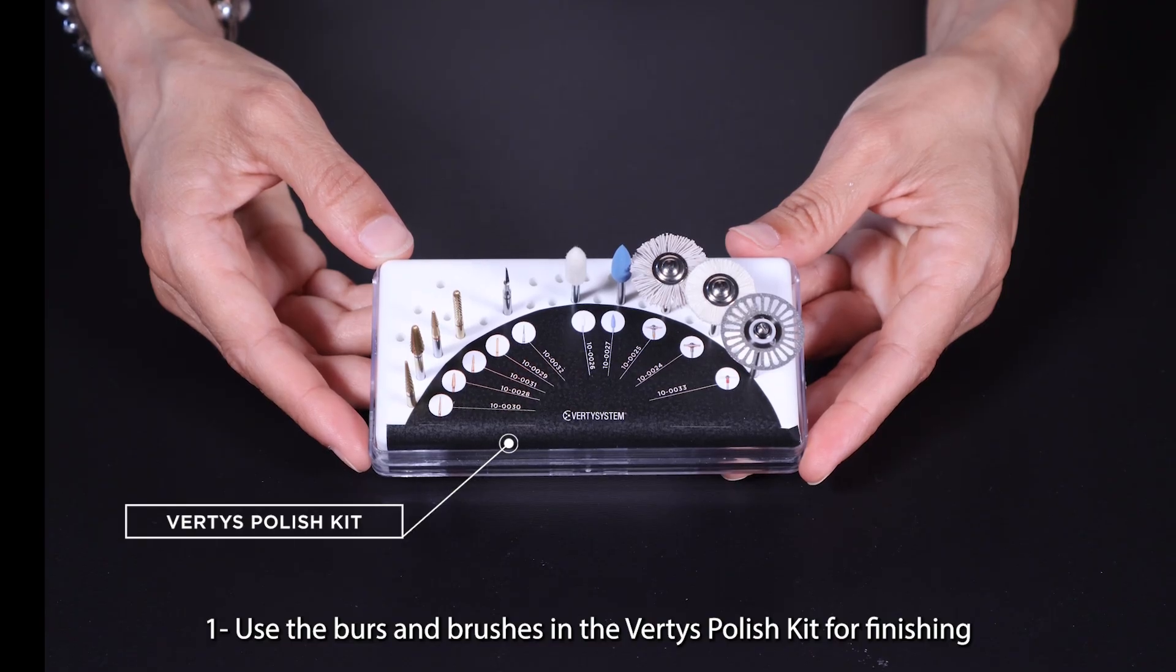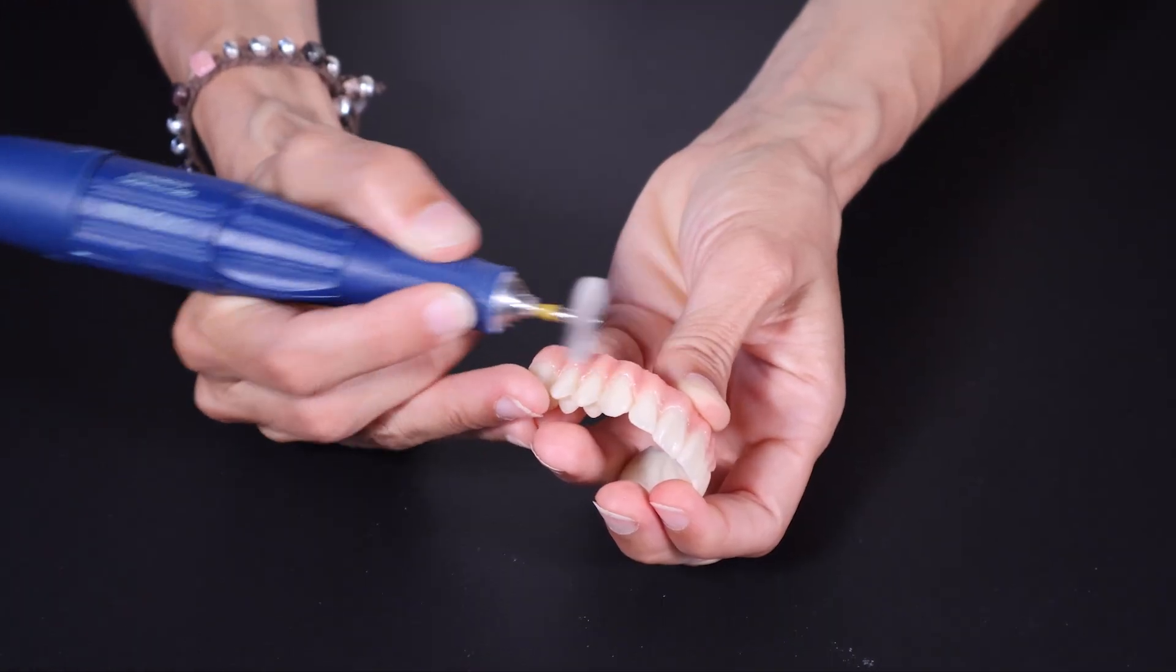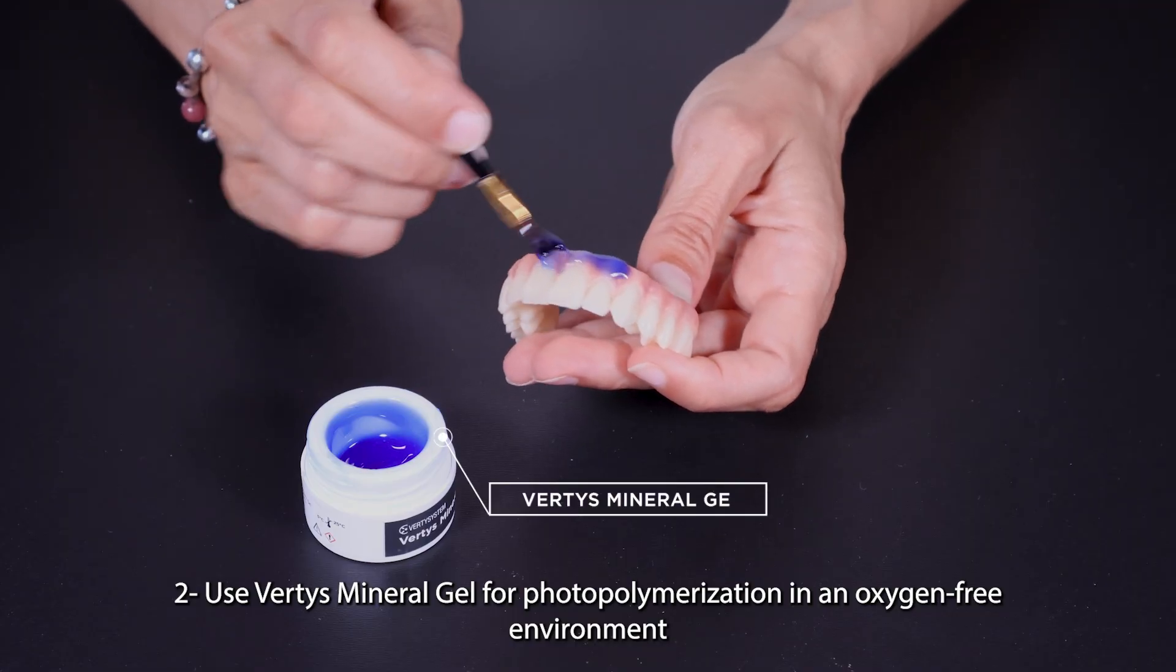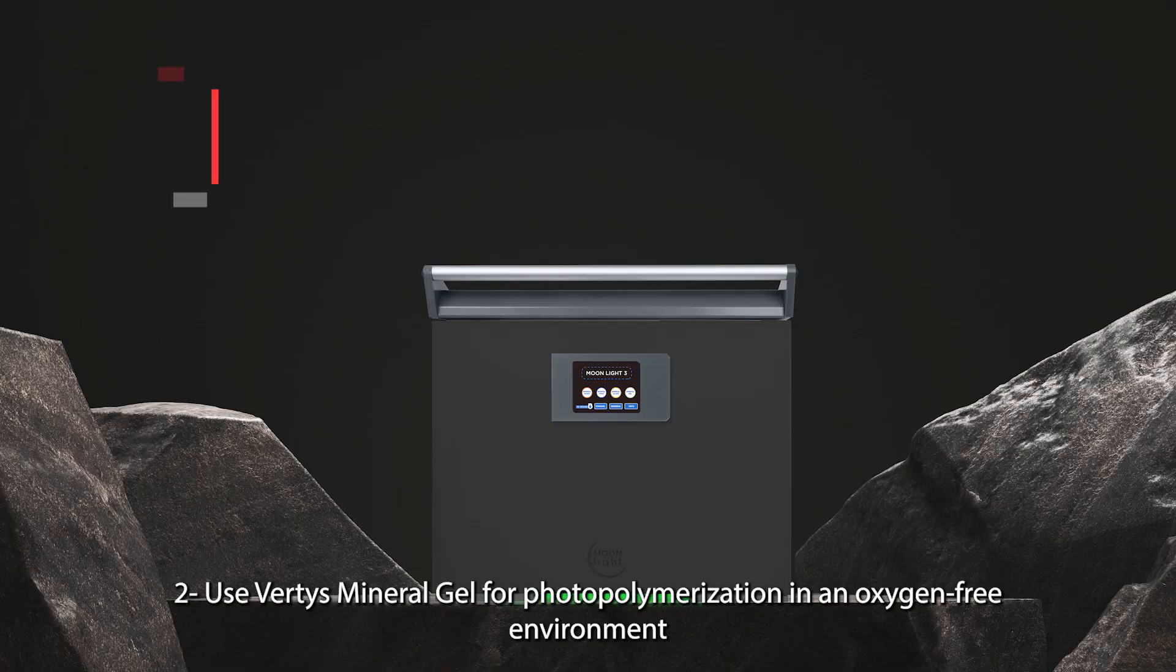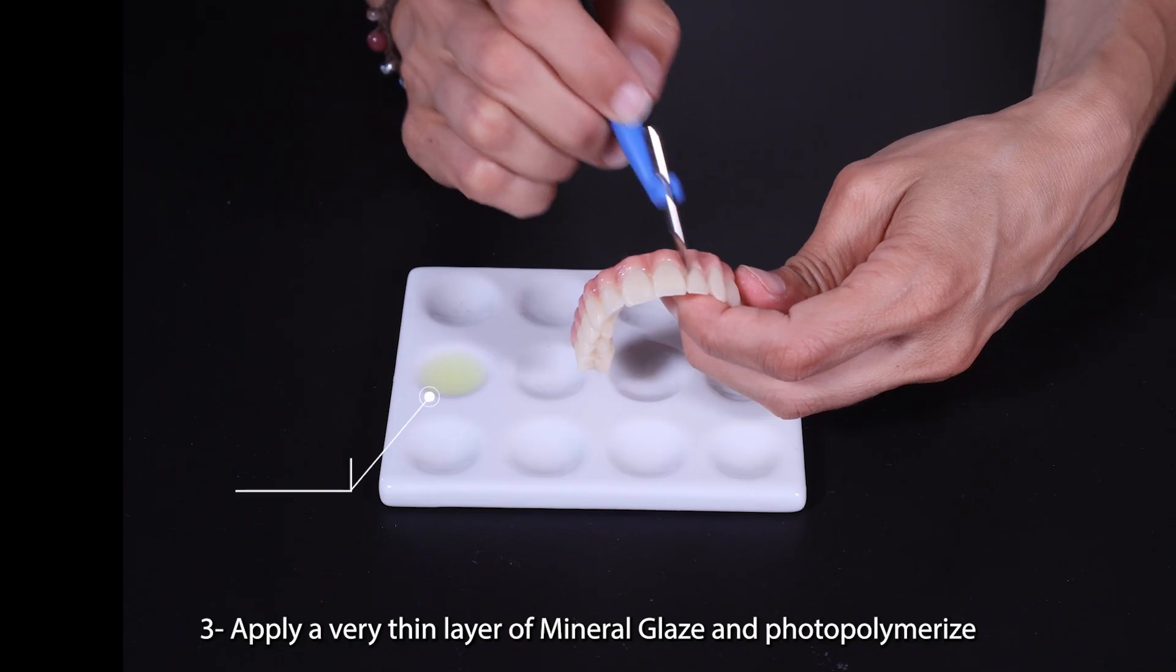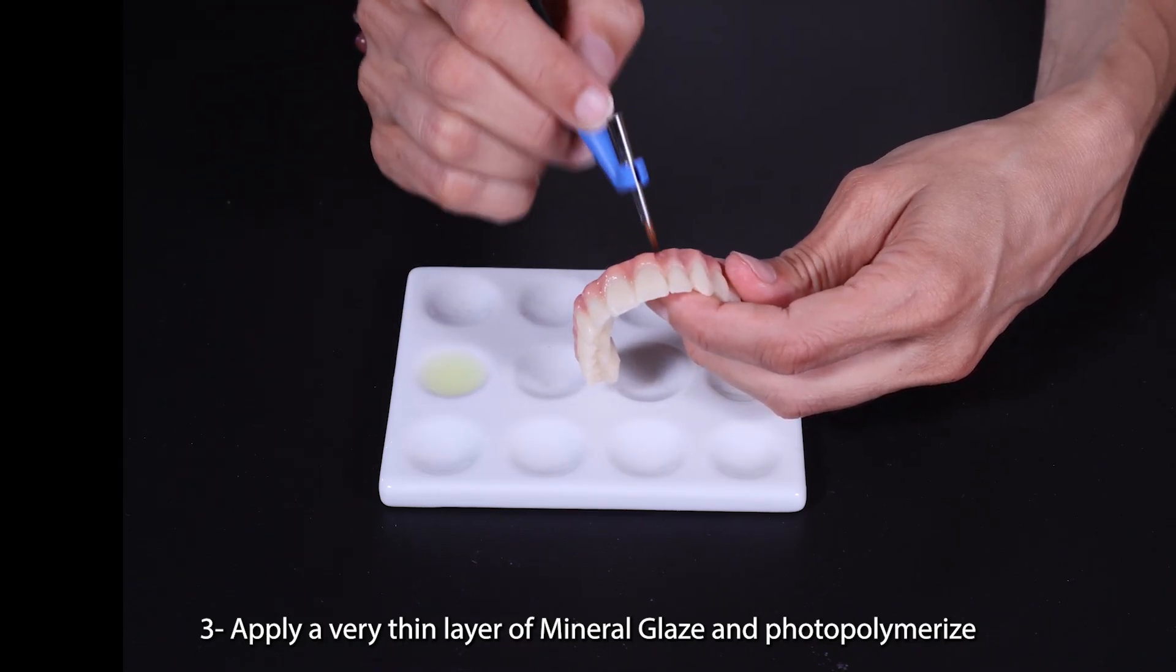The final steps are in the following order: One, use the burs and brushes in the Vertis Polish Kit for finishing. Two, use Vertis Mineral Gel for photopolymerization in an oxygen-free environment. Three, apply a very thin layer of Mineral Glaze and photopolymerize.